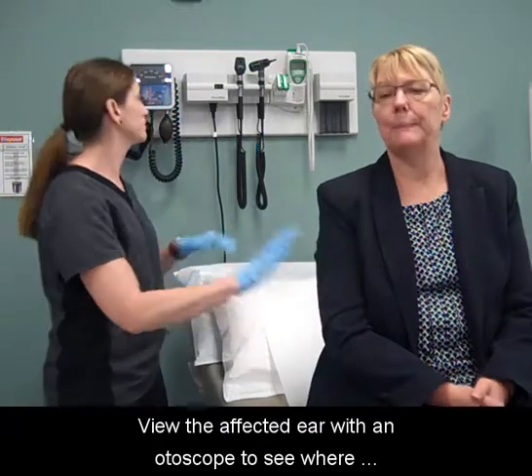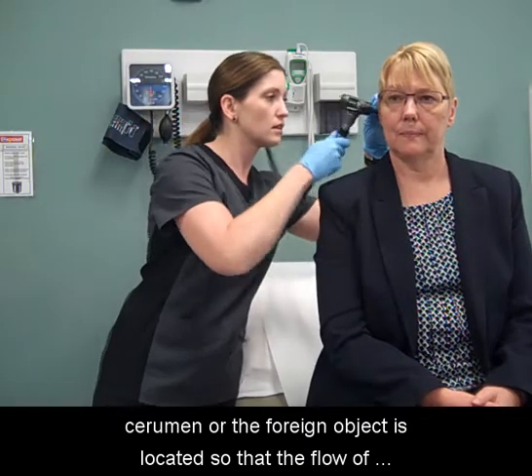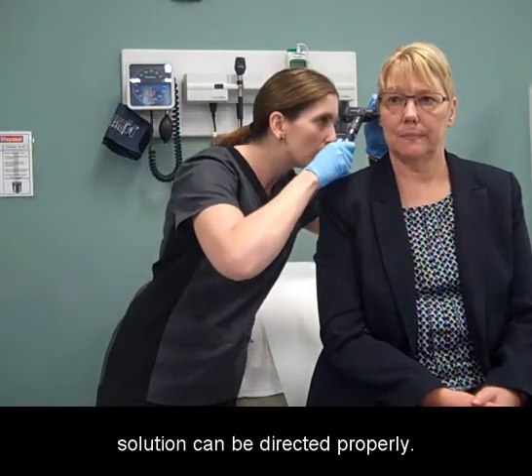View the affected ear with an otoscope to see where cerumen or the foreign object is located so that the flow of solution can be directed properly.